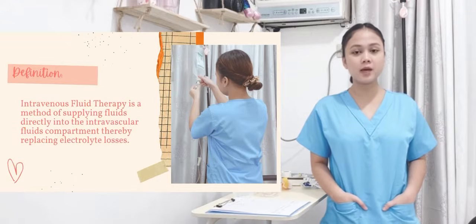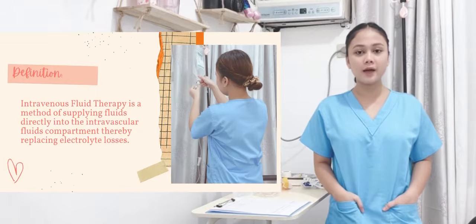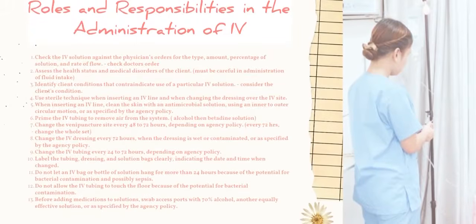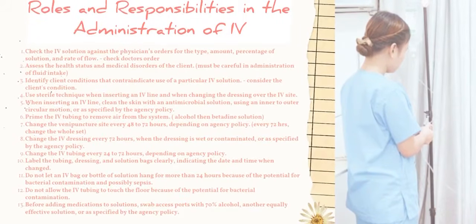Good day, so today I will be demonstrating the different procedures of IV fluid therapy. This therapy is a method of supplying fluids directly into the intravascular fluid compartments, thereby replacing electrolyte losses. So here are the roles and responsibilities of a nurse in an administration of IV.